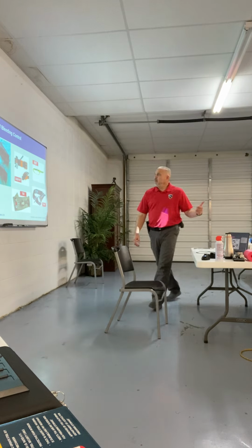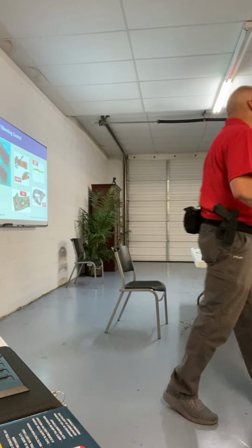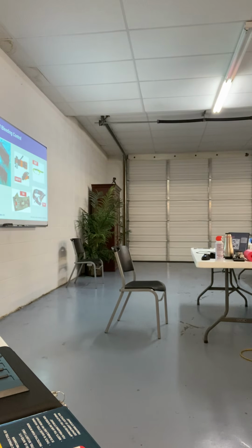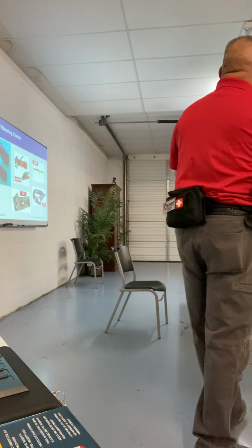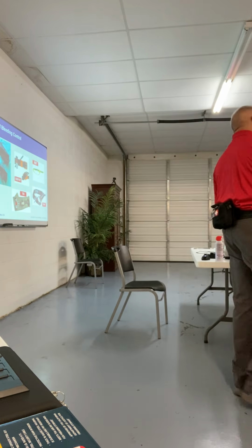The last point I want to make to you about these tourniquets is everybody take your tourniquet and take the windlass. All right, Tex, don't pick that gun up again, okay? I want you to take the windlass rod and try to break it. Bend it as hard as you can. I don't care if it breaks.